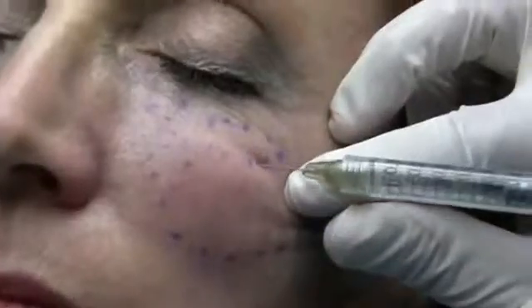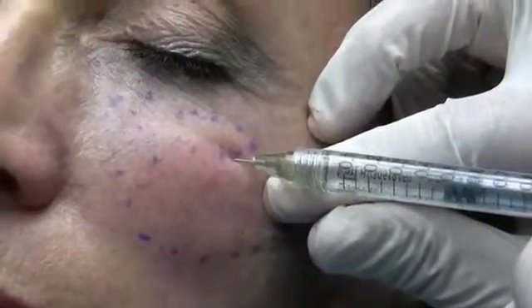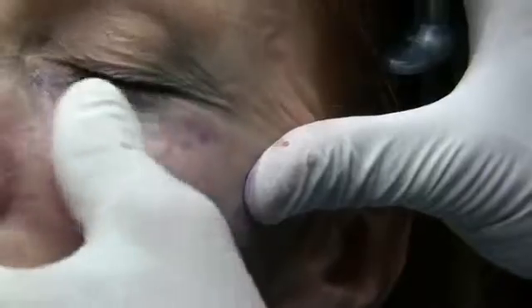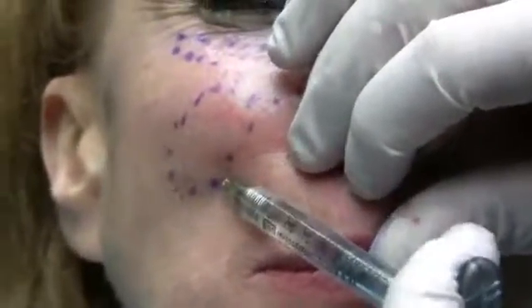So it's a great little procedure, and fillers have really changed cosmetic surgery in the last decade. And it's important to have good overhead lighting because the shadows are really important as well.